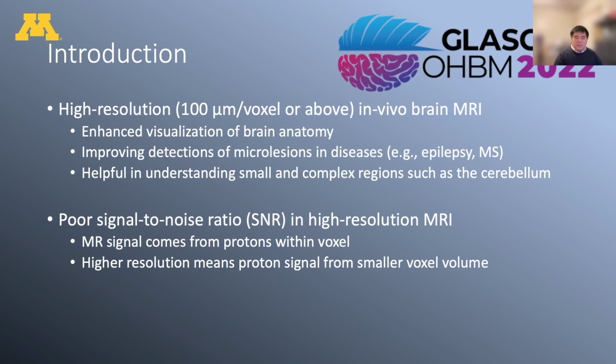However, any increase in spatial resolution comes at a cost to signal-to-noise ratio, and that is because MR signal comes from protons within a voxel, and having a higher resolution image means signal will be coming from a smaller volume.